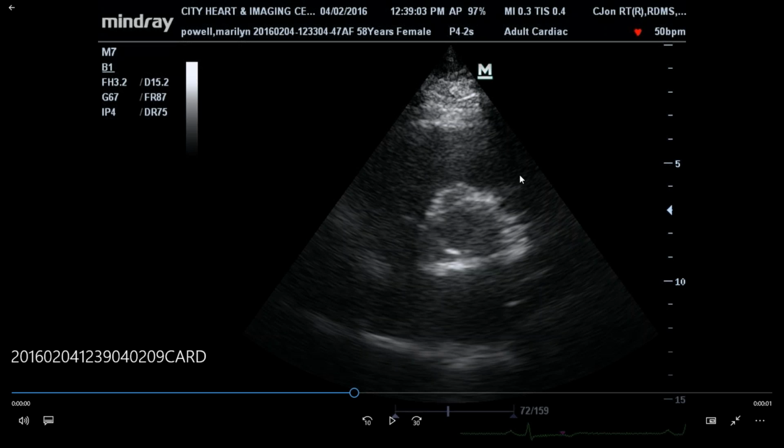Okay. So again, up here you have the right ventricle. This is your right ventricle inflow tract and your right ventricle outflow tract. So the tricuspid valve is right there. This is the right atrium. Your atrial septum is right there. This is the left atrium. Remember, the cusp which is adjacent to the atrial septum is the non-coronary cusp. Non-coronary cusp is right there. This is the right, and this is the left. Okay.